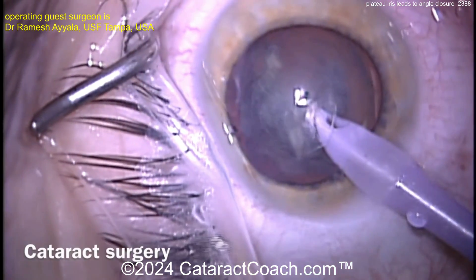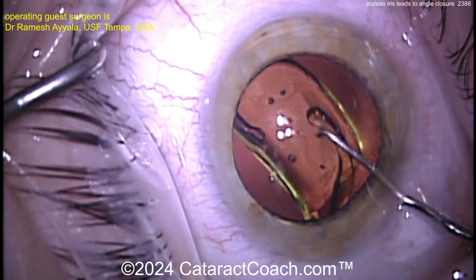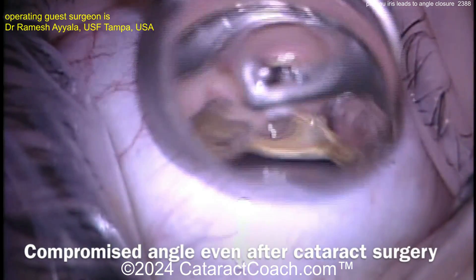This is the only eye of a plateau iris patient with pressure of 35 or more on max meds plus Diamox. The patient already had argon laser iridoplasty, YAG-PI, chronic angle closure, and of course cataract.